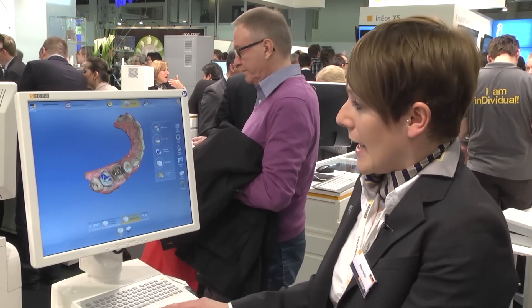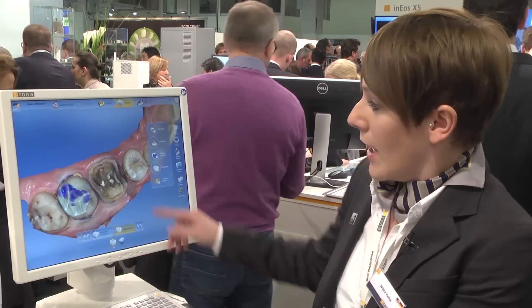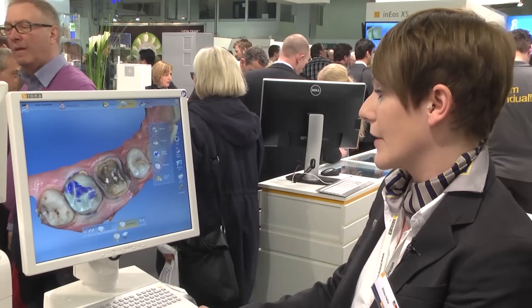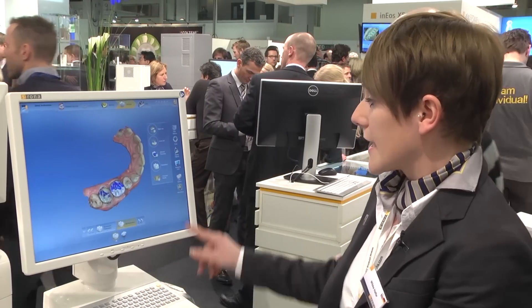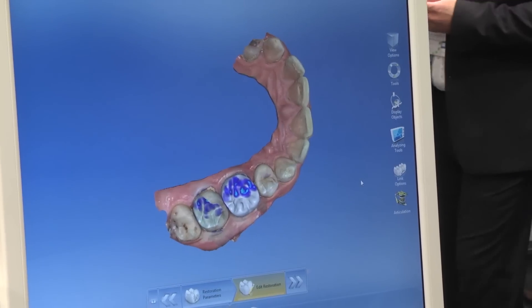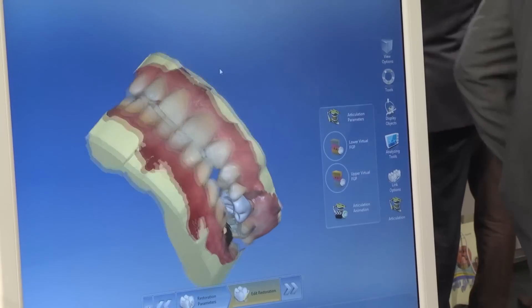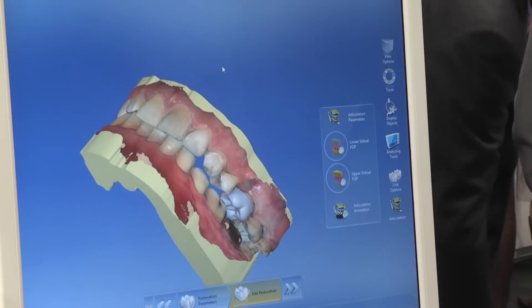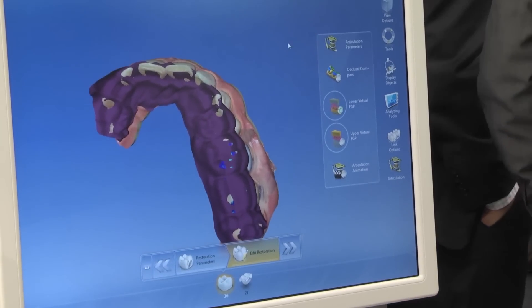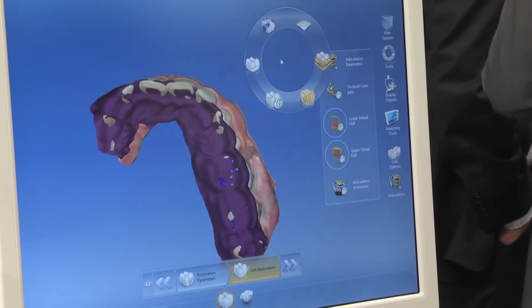Here you see the third advantage of the new CEREC software 4.2 — the so-called virtual articulator. This is a real OmniCam case, colored, showing all the available information. For the articulator, you click on articulation on the right, setting all the parameters available. In addition to static contact surfaces, the articulator function also allows you to determine dynamic contact surfaces and improve correct functional occlusion. The software displays the complete path of movement, and the instruments allow individual intervention to remove early contacts in the occlusion with just one click.